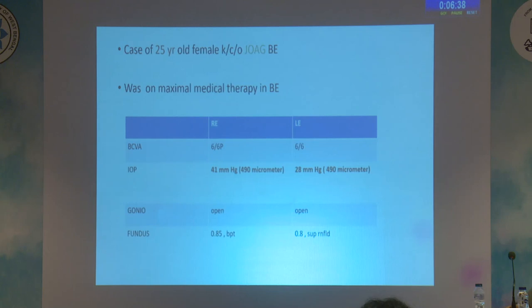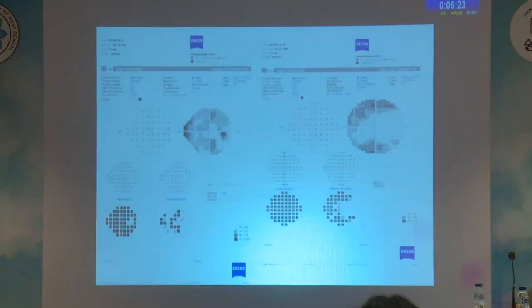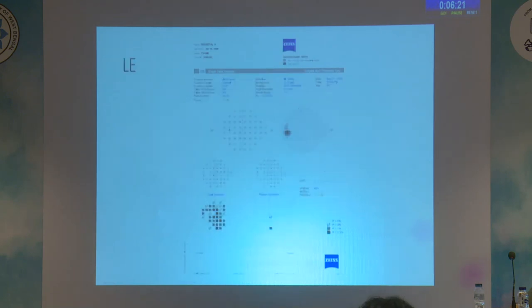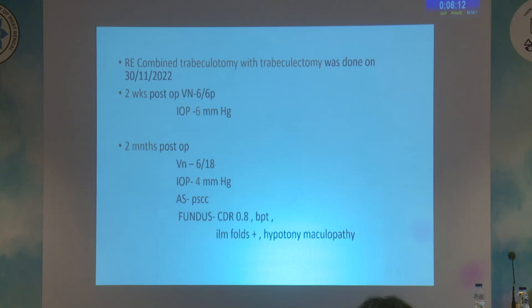So here is the case of a 25-year-old female who was diagnosed with juvenile open-angle glaucoma in both eyes with advanced cupping and uncontrolled intraocular pressure despite maximal medical therapy. This is the fundus picture showing advanced cupping in both eyes, with an advanced field defect in the right eye and an early field defect in the left eye, and OCT corroborating the above findings.